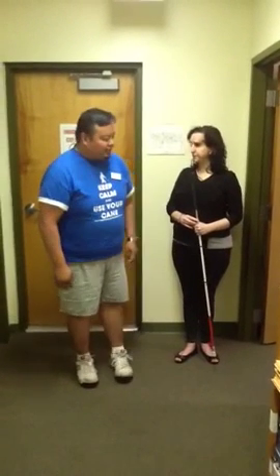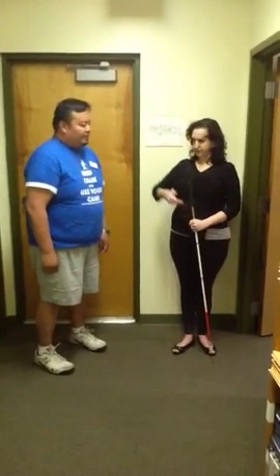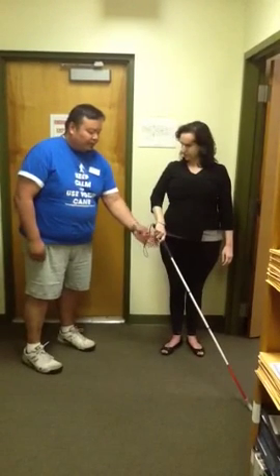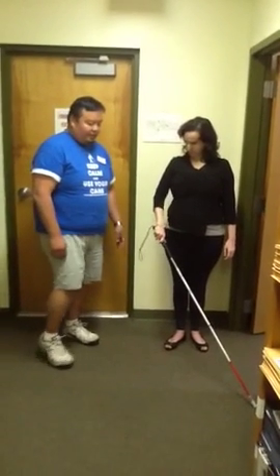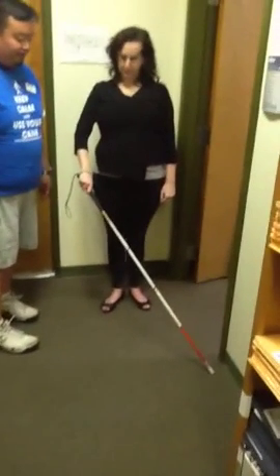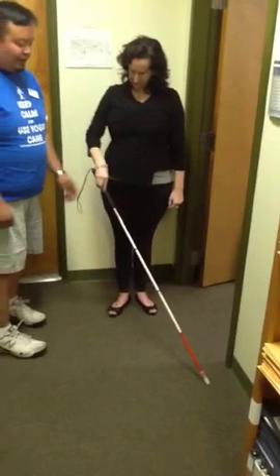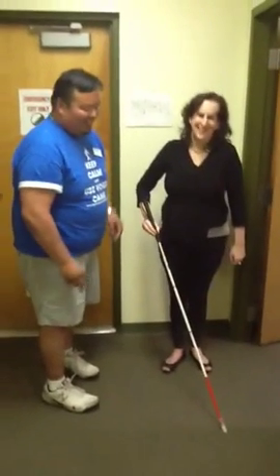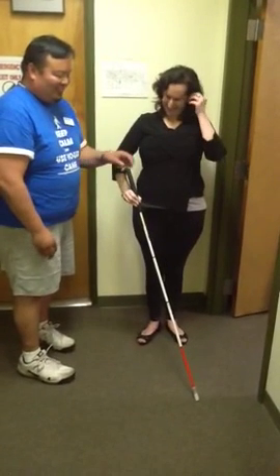And can you please show me diagonal again? Yes. There you go. And remember, your thumb's always on the flat side. That's the preferred method that you like to use. Can you show me pencil grip? Remember, you're holding it like a pencil. That's right. I know it's something you got to get used to.